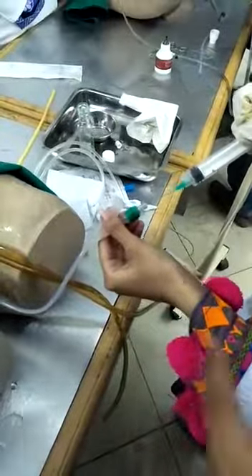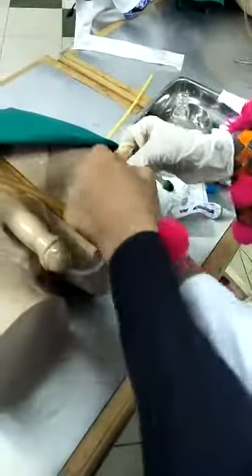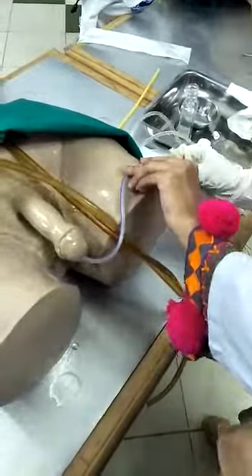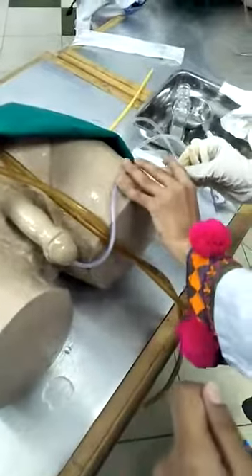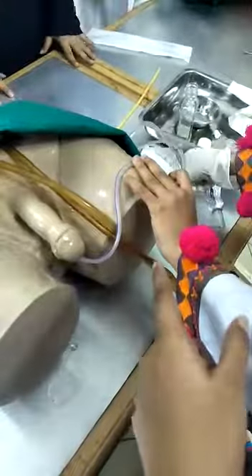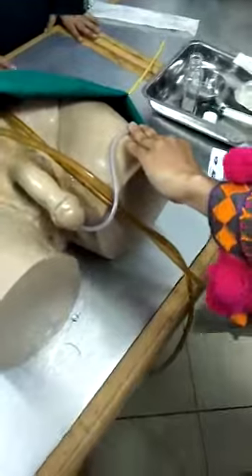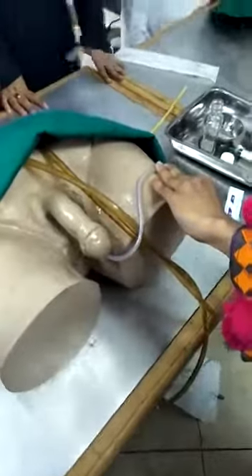Then we have to inflate the balloon. Hold the bung and put a grip on the tube — 10 cc distilled water. Then pull the tube and check the balloon. You will feel resistance. Here I have to put a tape attached, and we are done with the procedure.